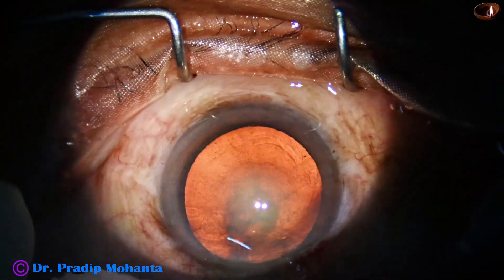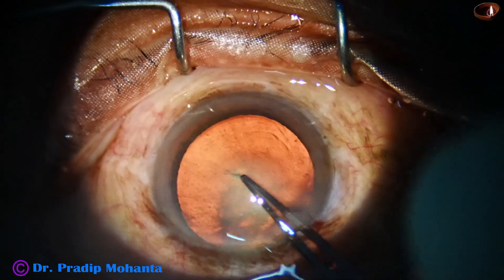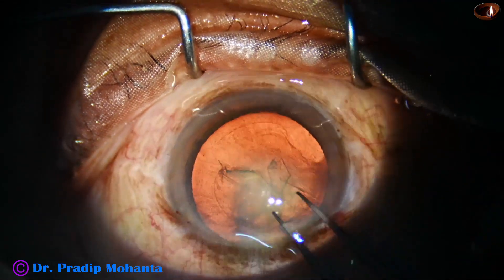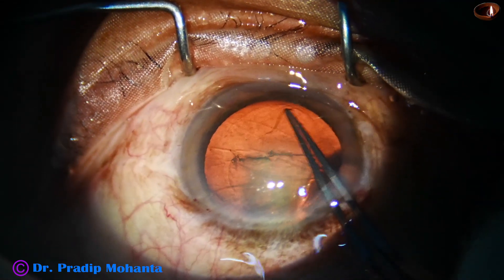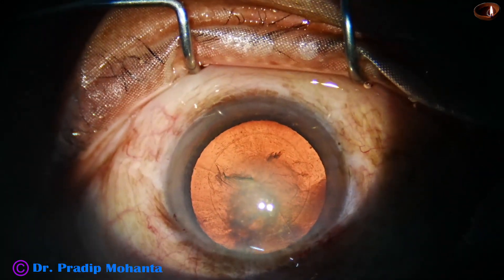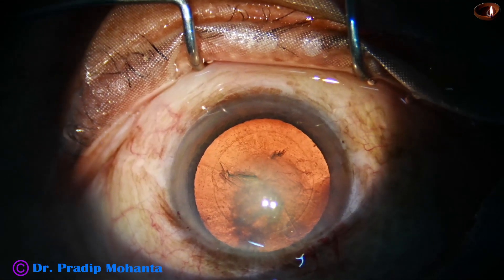And now capsulorhexis. This is a Utrata forceps, very thin, and this instrument is very good for capsulorhexis.